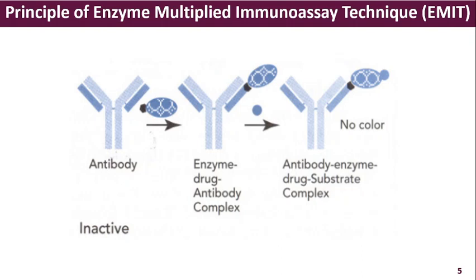And you already have antibodies that are produced in the animals which are available in the market against all these drug molecules or drug metabolites or the hormones or the anabolic steroids. And these antibodies are specific for these drug molecules or hormones or the performance enhancing drug molecules. So the antibody can readily bind to the drug molecule through the FAB site.